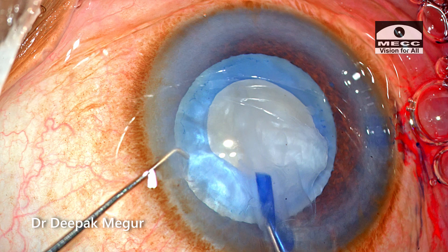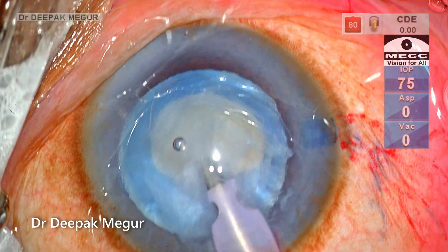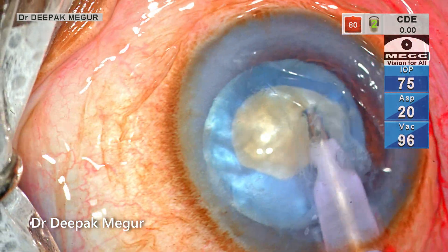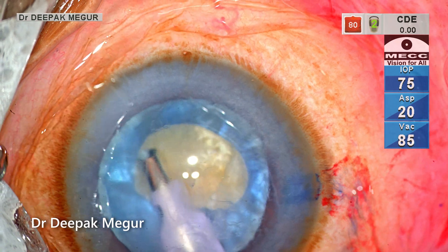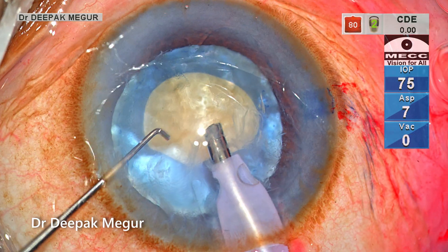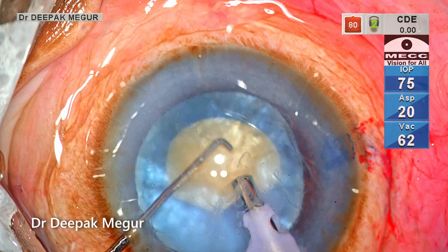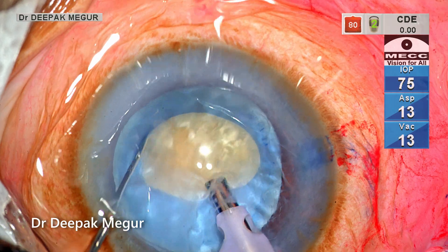As we close the rhexis, there's a lot of lens matter that has egressed out into the anterior chamber. Before I enlarge the capsule, it's mandatory that I decompress the back. In this case I've decided to do the decompression with my phaco probe itself — going in with the phaco probe and the second instrument to aspirate the overlying cortex and epinucleus.